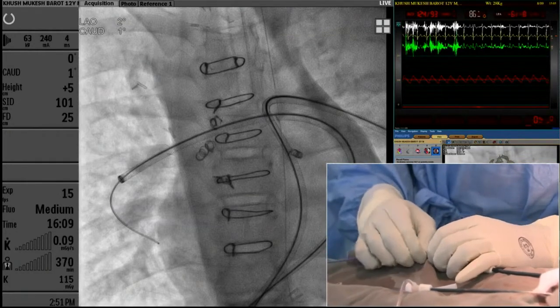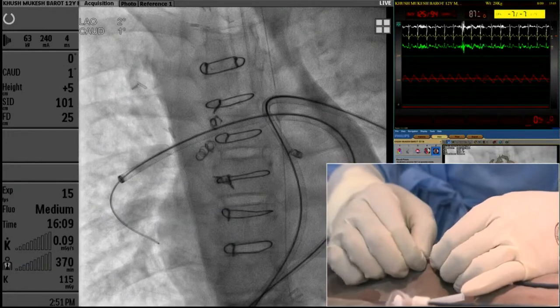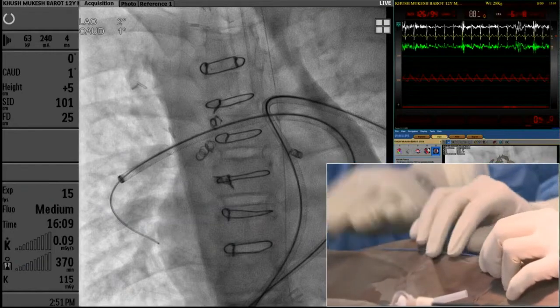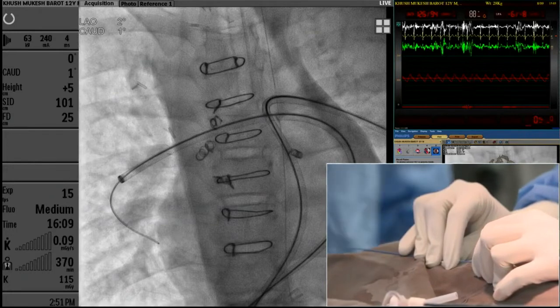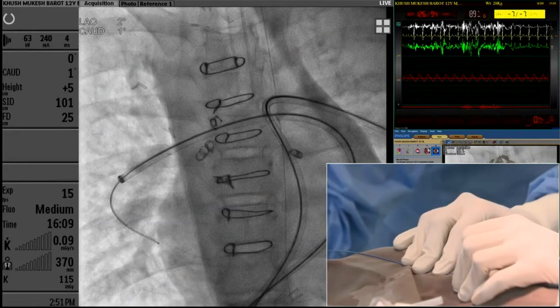I sincerely believe that there won't be any sensible response to balloon dilatation on a permanent basis. It is partly Gore-Tex and partly bovine pericardium, and with my balloon, if this vessel is going to stay permanently open for the rest of its life, I'll be very surprised. I don't believe in pulmonary artery balloon dilatation alone in the mediastinal pulmonary arteries. But what will be your view, Chetan?